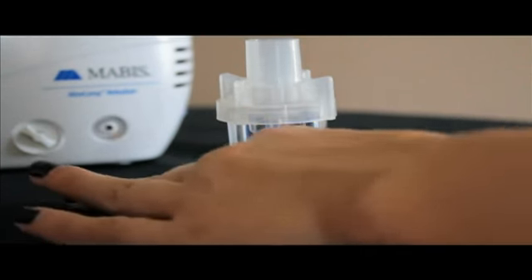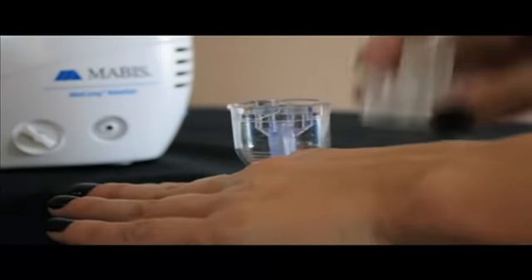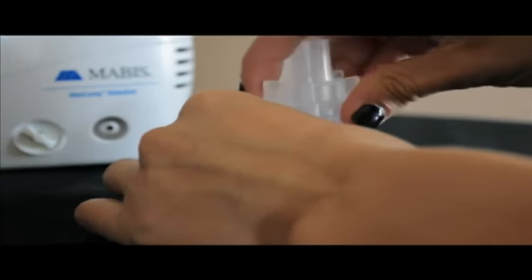Remove the cover of the nebulizer by gently turning and lifting. Check to make sure the PurpleJet is properly installed. Add prescribed medication into the nebulizer.